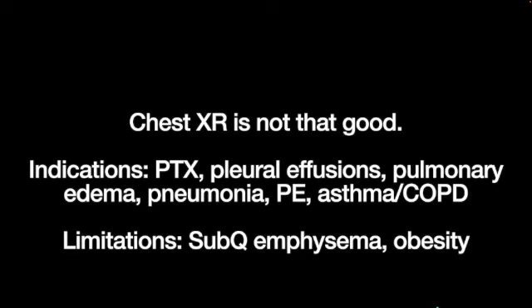A frequent complaint that we hear from many patients, particularly in our line of work in the acute care setting, is "I'm short of breath." How are we going to take point-of-care ultrasound to assist in helping our patient in the hospital? But first, why do we want to incorporate point-of-care ultrasound for undifferentiated dyspnea? I already mentioned that our physical examination lacks sensitivity. Also, chest x-ray lacks sensitivity.